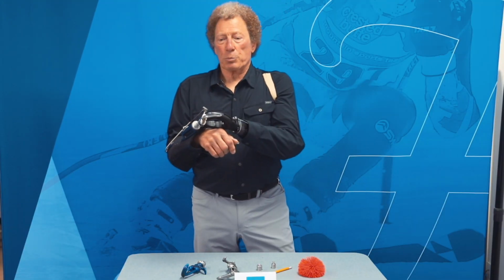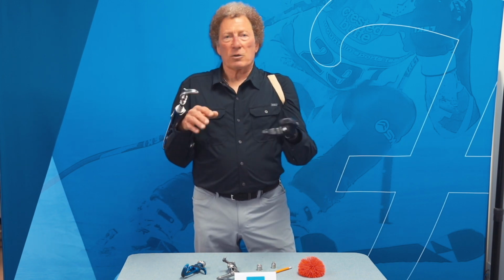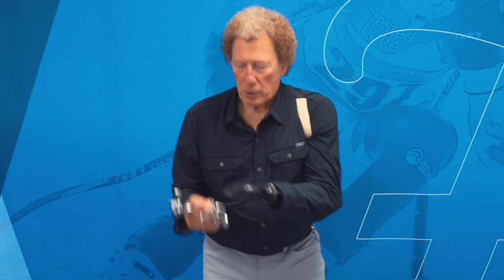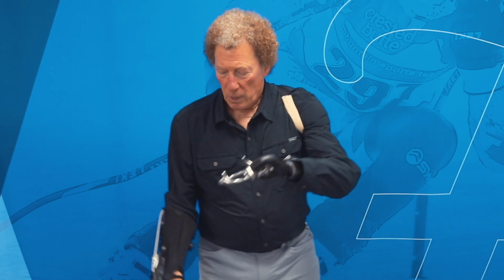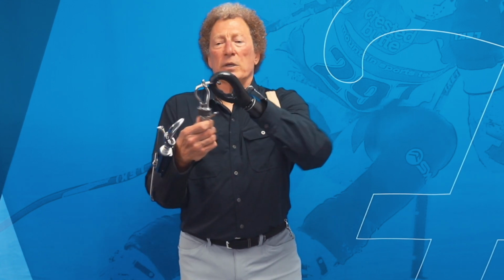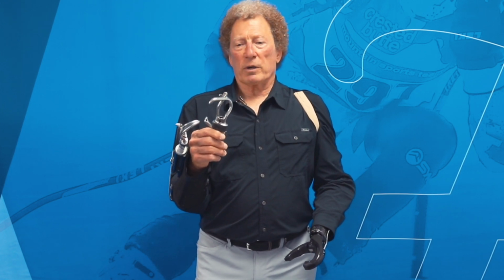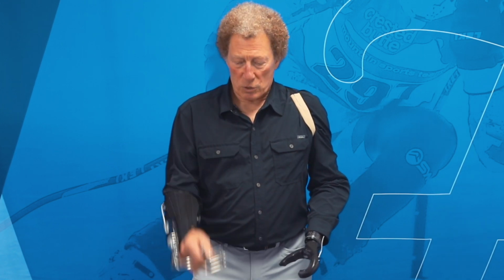Okay, let's talk about the split hook. It's been around for a long time. It's 1950s technology. It's simple, reliable. Split hooks come in a wide variety of shapes and materials. This is a lighter weight aluminum hook. This is a very heavy duty farmer's hook. This is a number 7 style hook used for very rural ranching work, things like that. They have different attributes and different shapes, but they still operate all the same way.